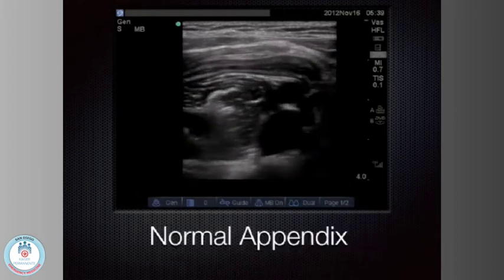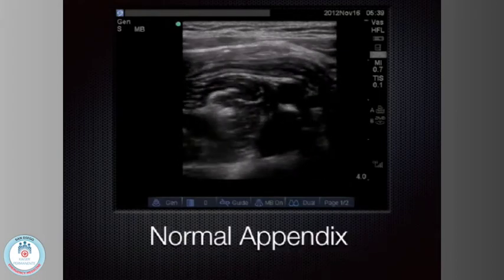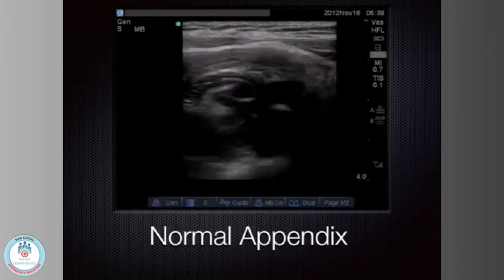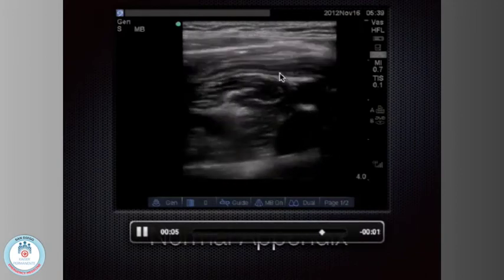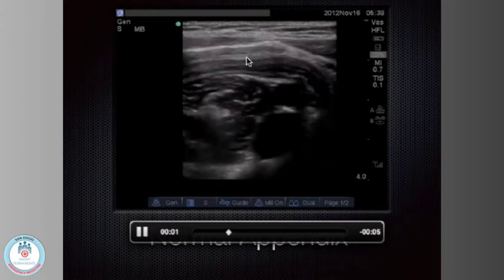This is another normal appendix here, kind of stretching all the way across. Some of them are kind of long. I don't know if you can... oh yeah, it comes up pretty good. Can you point out which? Sorry, yeah. So this is all the appendix coming along here.